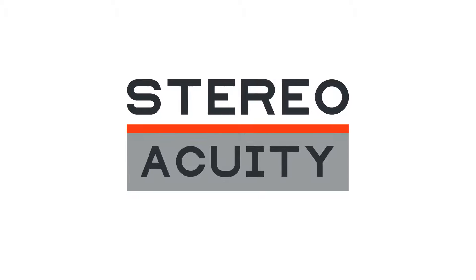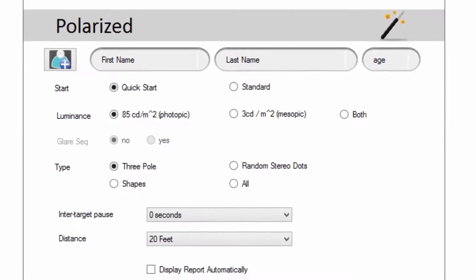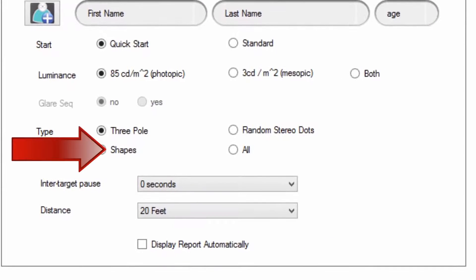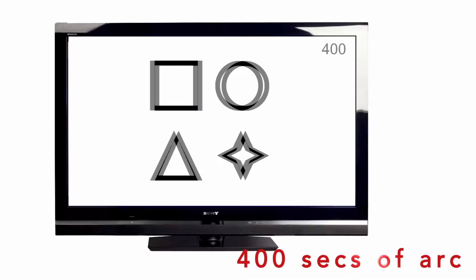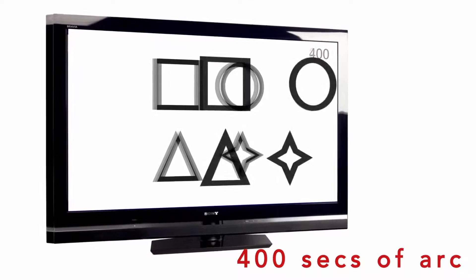Evaluate your patient's stereo acuity. Tests use either shapes, poles, or random dots to test the patient's arc second threshold.